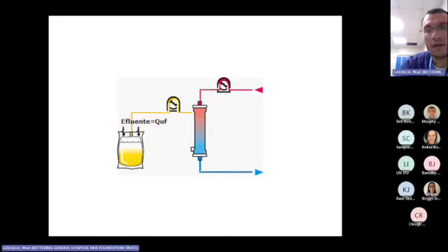It's a very simple principle. We just get the blood from the patient through the arterial line, or the red side of the vascular catheter. We have only the ultrafiltration pump, and the blood is going back to the patient, and the filtrate is being collected. So it's very simple, and we use only a pressure gradient.